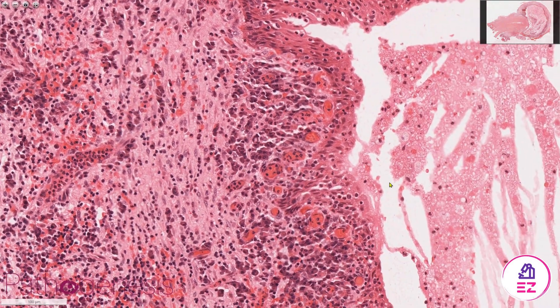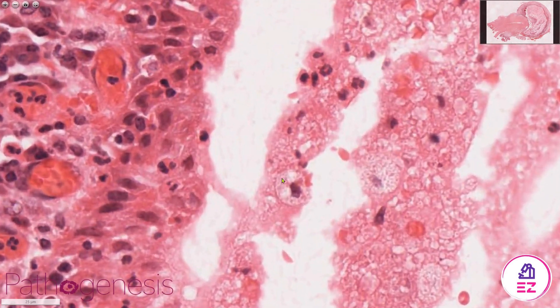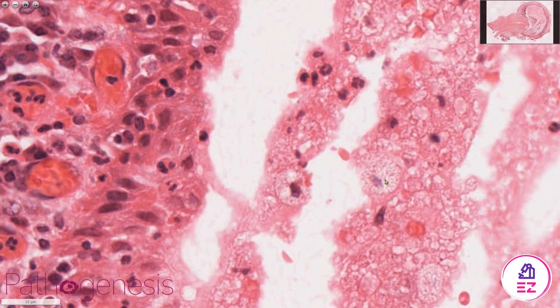Finally, I'm going to point out a macrophage — not a neutrophil. There's one here and another here, and we can also see a couple of neutrophils nearby. Macrophages tend to have a centrally placed nucleus, and in this case the cytoplasm is quite swollen because these macrophages have been busy engulfing material within this cyst. Macrophages tend to have quite pale cytoplasm and can congregate in cystic lesions.